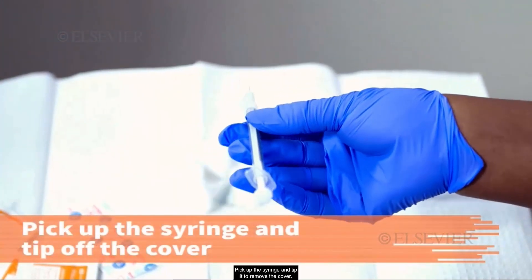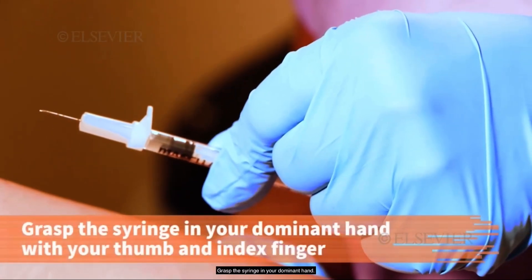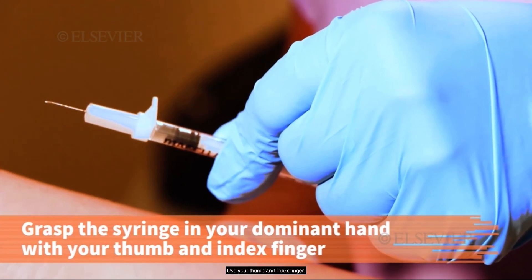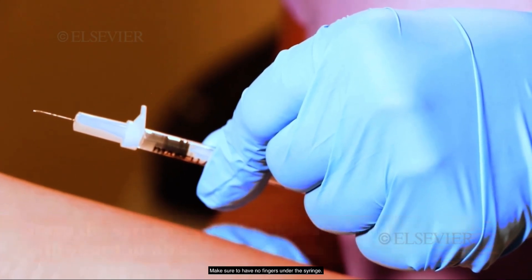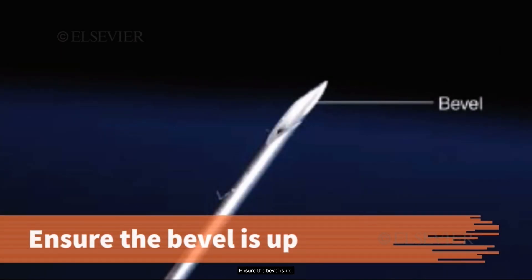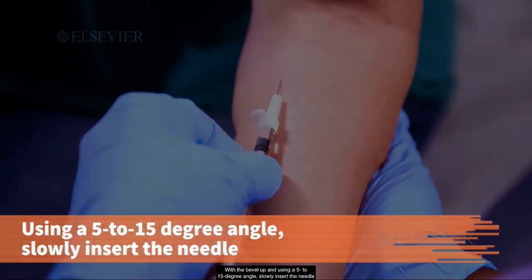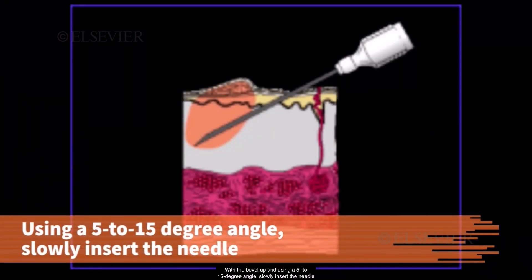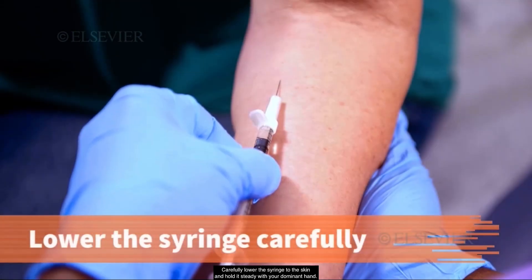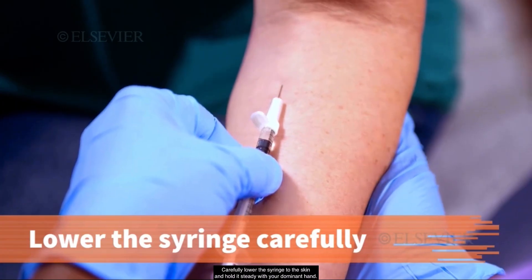Pick up the syringe and tip it to remove the cover. Grasp the syringe in your dominant hand using your thumb and index finger. Make sure to have no fingers under the syringe. Ensure the bevel is up. With the bevel up and using a 5 to 15 degree angle, slowly insert the needle until the bevel is covered with skin. Carefully lower the syringe to the skin and hold it steady with your dominant hand.